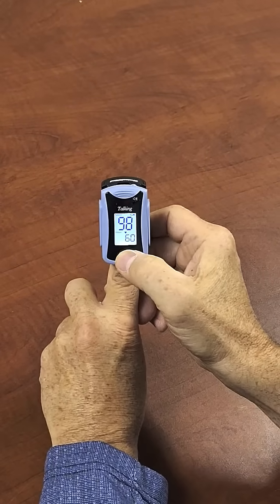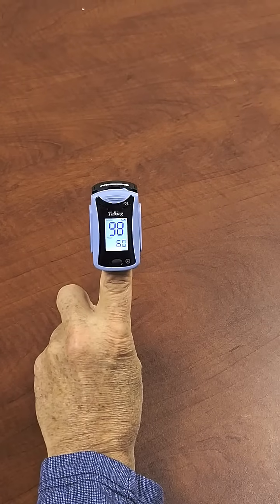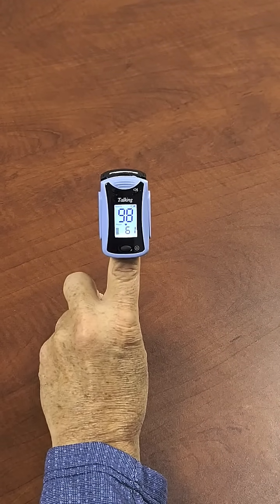Now we press and hold the button. Press the button until it starts to talk.